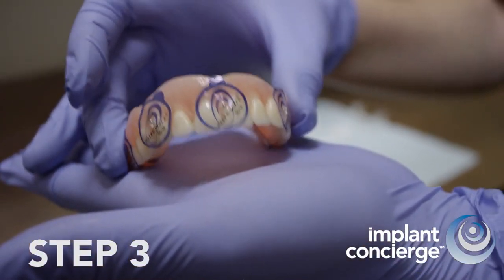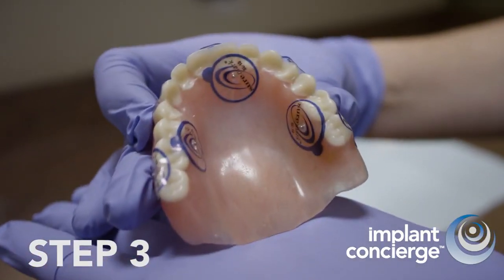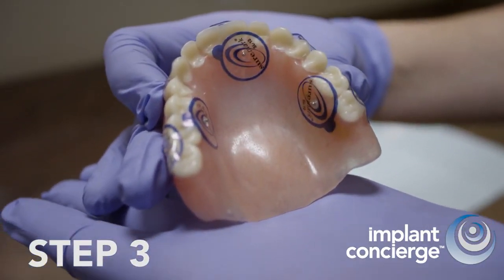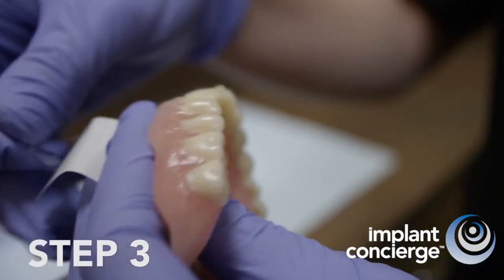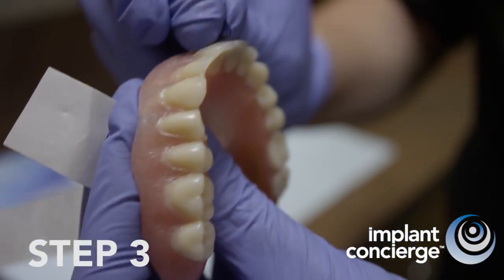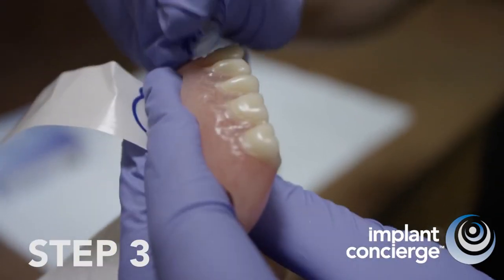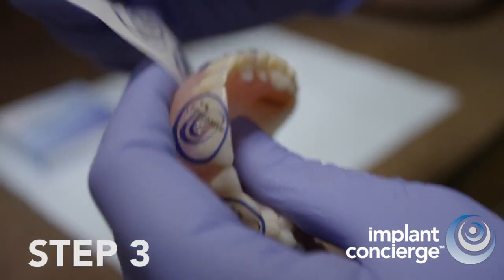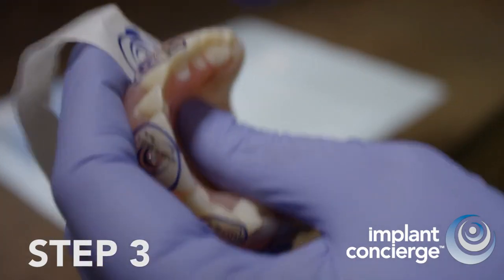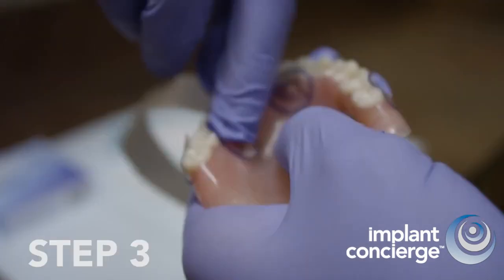Adhere 6 to 8 one-millimeter x-ray markers to the denture. You can purchase a box of 110 x-ray markers directly from Implant Concierge. Peel and stick 3 to 4 x-ray markers on the buccal surface at varying axial levels. Be random. Here's a helpful idea: place two of the stickers on the first premolar cusp to help you quickly determine restorative space and if bone reduction will be required.